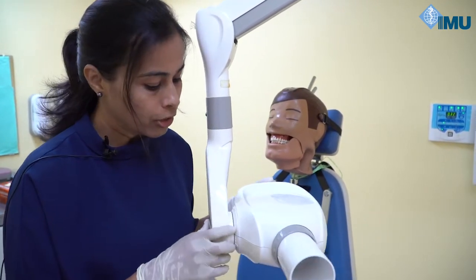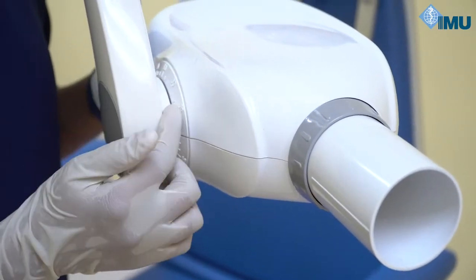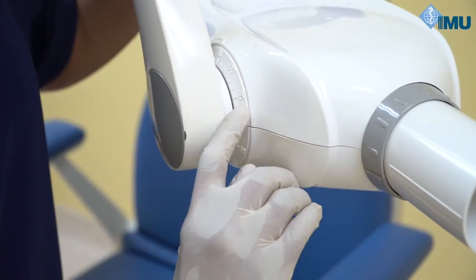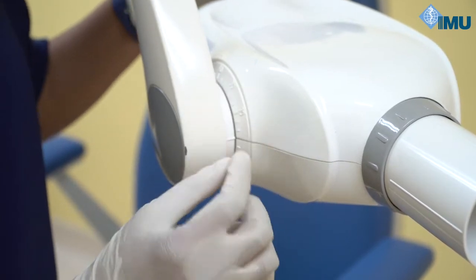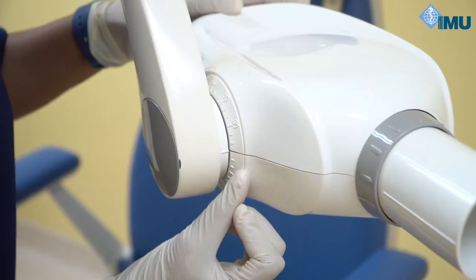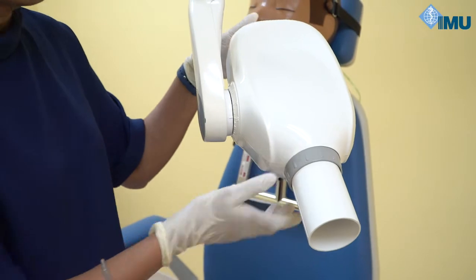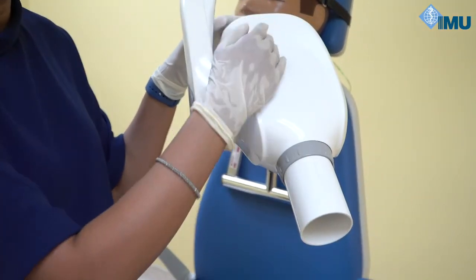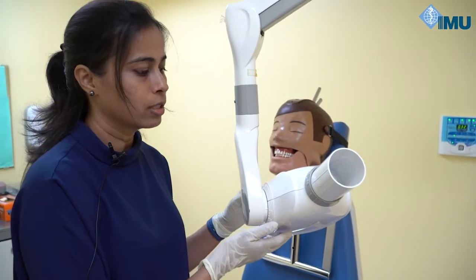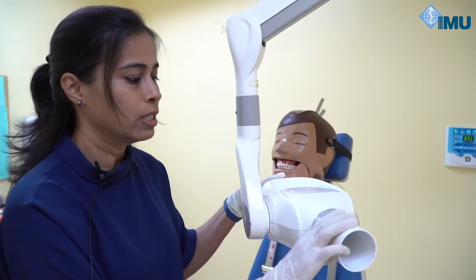In bisecting angle technique, each tooth has a specific angulation. You can read the angulations on the x-ray tube — numbers are written there. The tube is currently set at 0 degrees; markings above this line are positive angulation, below are negative angulation. If you move the tube head downward so the x-ray beam goes upward-to-downward, that is positive vertical angulation. If you direct the tube head upward so the beam goes downward-to-upward, that is negative angulation.